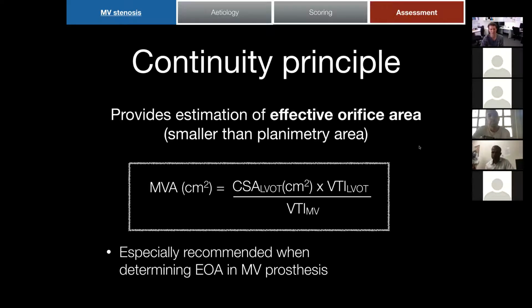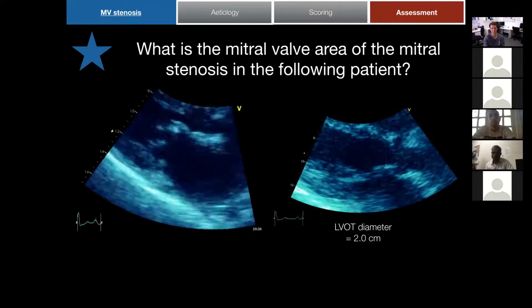Awesome, thanks. And I should say, in the ASE guidelines, I think they say they don't recommend doing this routinely unless you've got prosthetic valves. They don't mention the critically ill in there, but I put the critically ill in the same banner as this prosthetic mitral valve thing, because of the hemodynamic status, this is the best way of trying to analyze that.